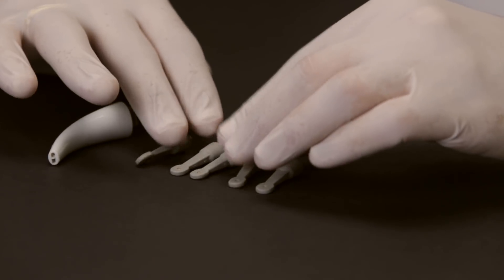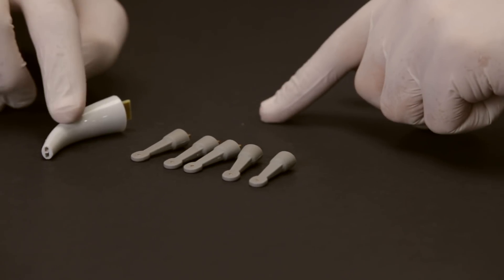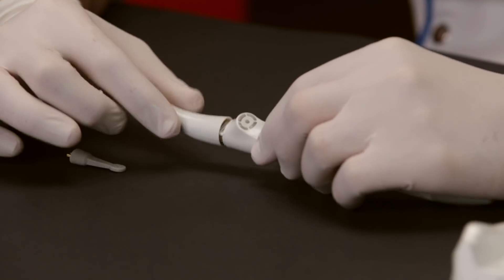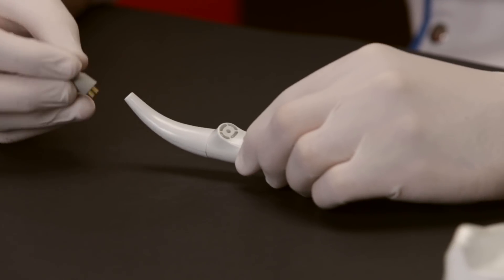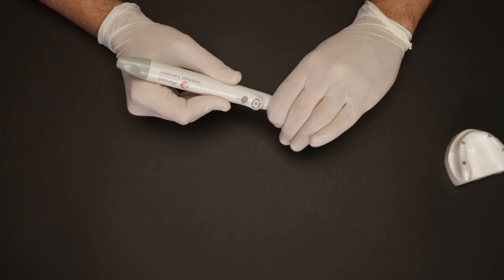The implant locator packaging includes six autoclavable sensor tips and it also comes with two sensor holders. This is how we can attach the sensor holder along with the sensor tip to the implant locator — the sensor tip fits into the sensor holder like this.